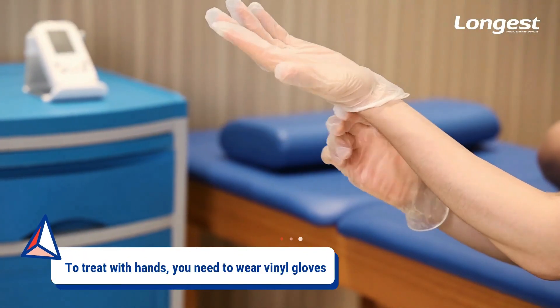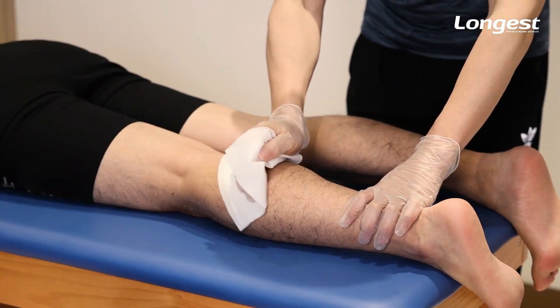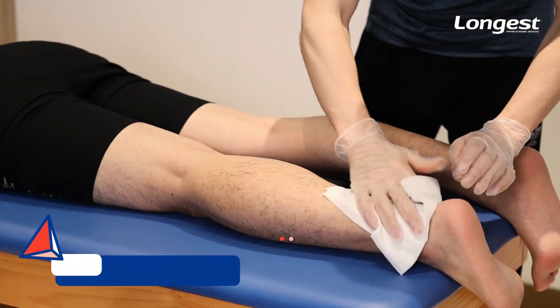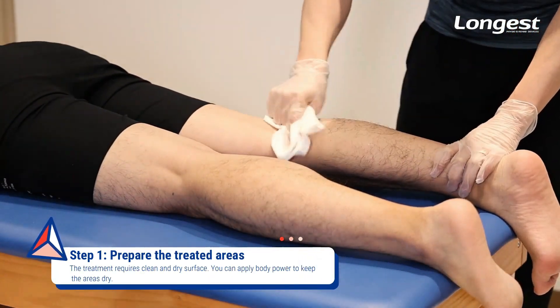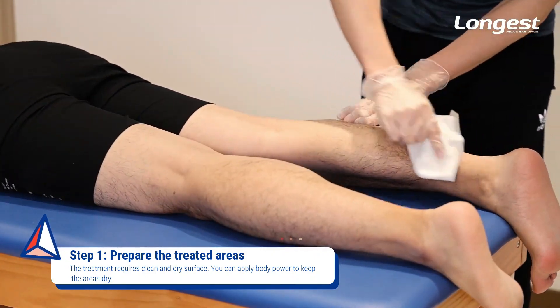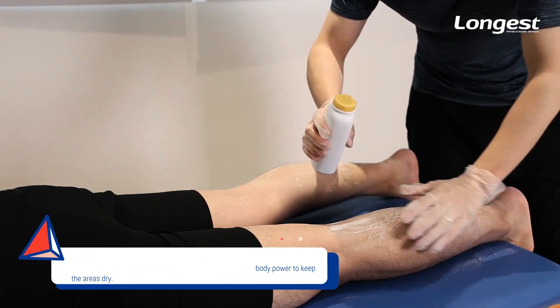For the treatment, you shall wear vinyl gloves. The treatment area requires a dry and clean surface to ensure the efficiency of treatment. Clean the treated areas using a cloth with 75% alcohol first, then dry it with a towel and use powder to remove any remaining moisture.